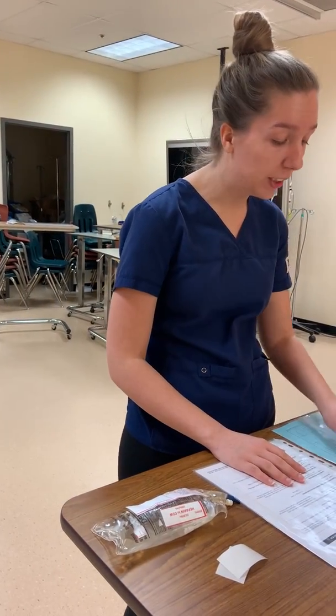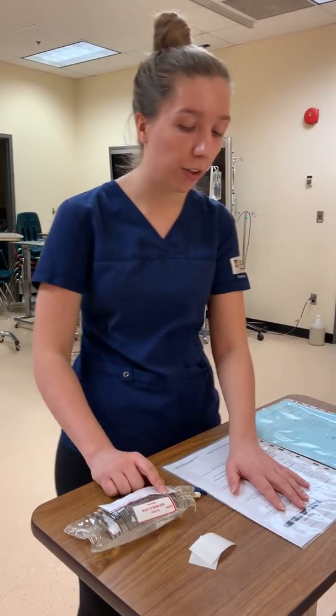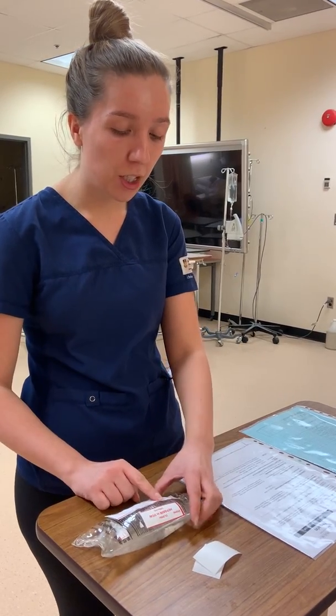So by looking at the bag, my label, my MAR, and my monograph, I'm going to start off with the correct patient. I have Wendy Holmes, the right patient. They have prescribed heparin. I have the monograph for heparin, a bag of heparin, and my label says heparin.